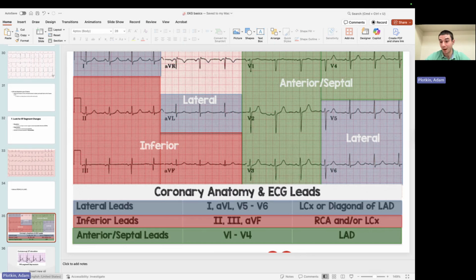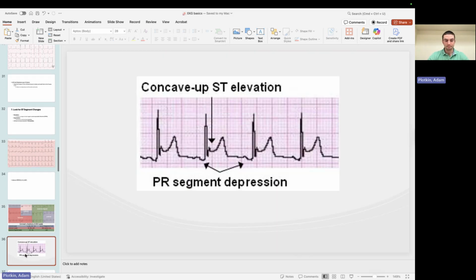So usually when I start seeing diffuse ST segment elevations, especially if they're concave up, and if the patient meets the clinical history, right? So pericarditis, right? Pleuritic chest pain, it feels worse lying down, feels better leaning forward, right? They could have a cough. You start thinking about a recent upper respiratory tract infection, inflammatory diseases, like all of my systemic collagen diseases, lupus, scleroderma, even RA, can potentially predispose. If a patient has a cancer, it can lead to pericarditis as well. So all malignant pericardial effusions. So all things to consider, right?